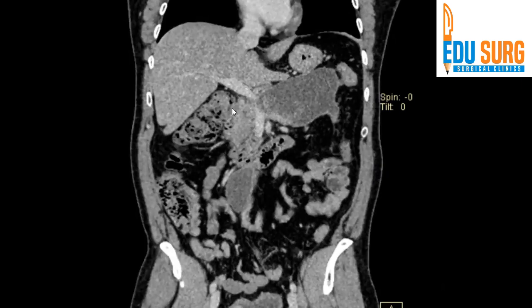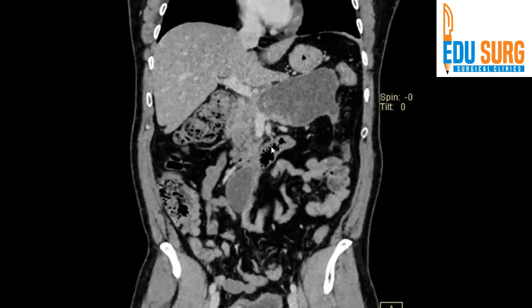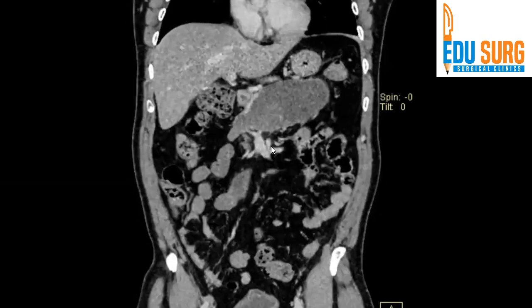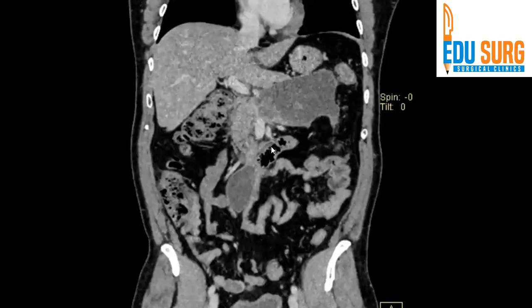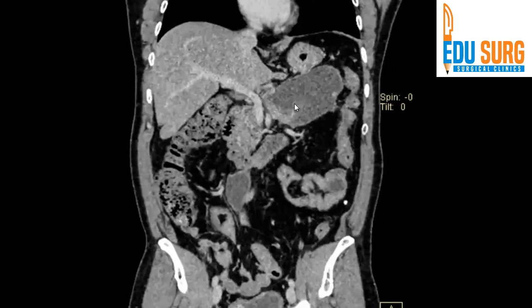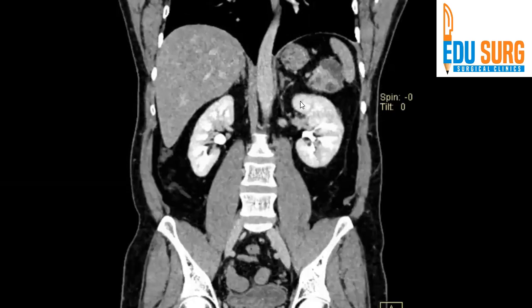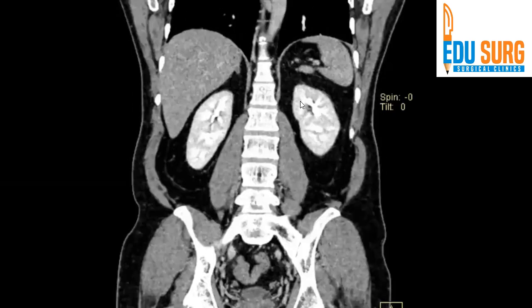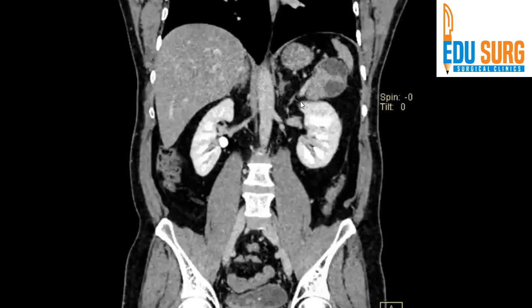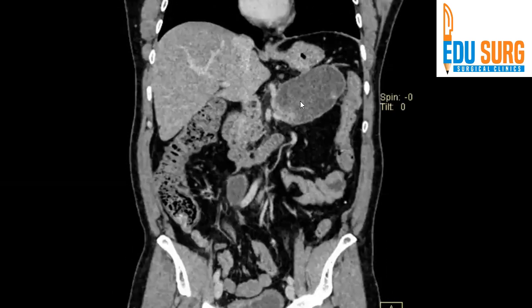This is the C-loop of duodenum, and this collection is separate from the main collection. So it is not going to be tackled if we do only one drainage of the main part. These are some of the very important points that you need to see when reviewing a scan like this.